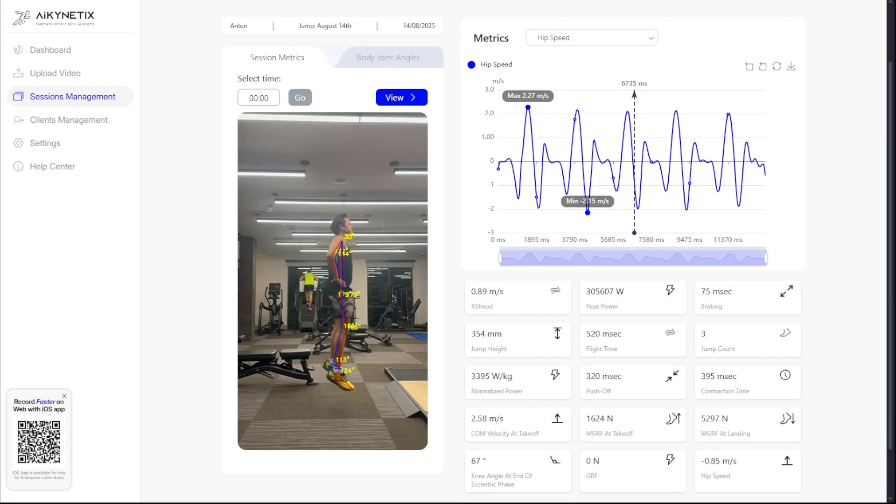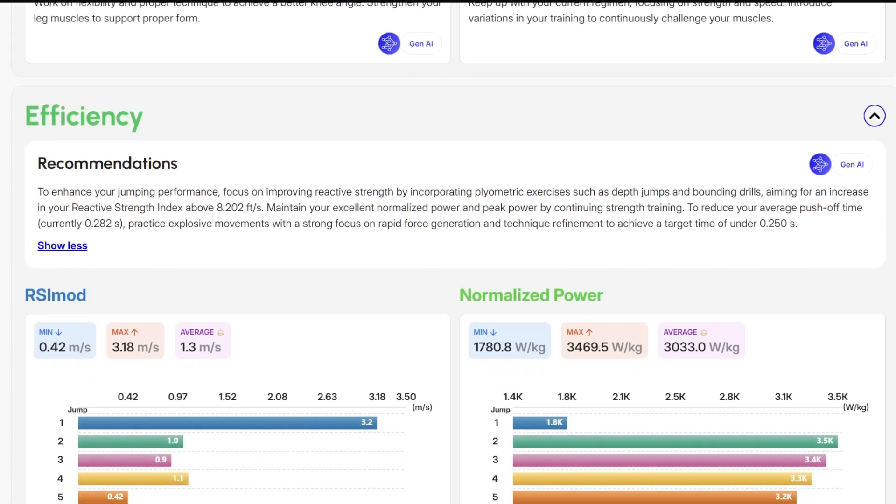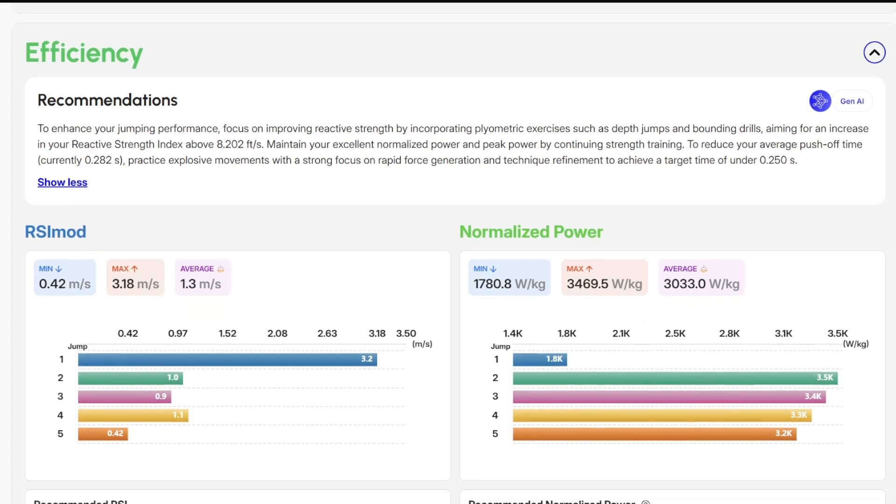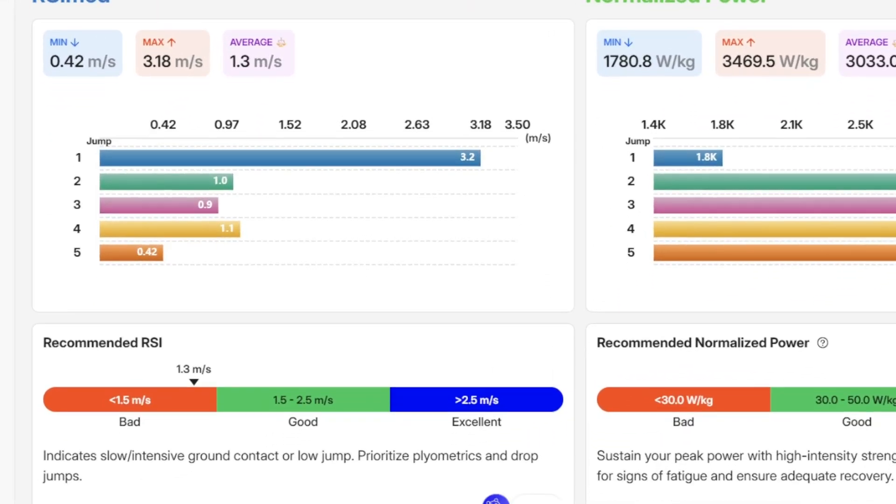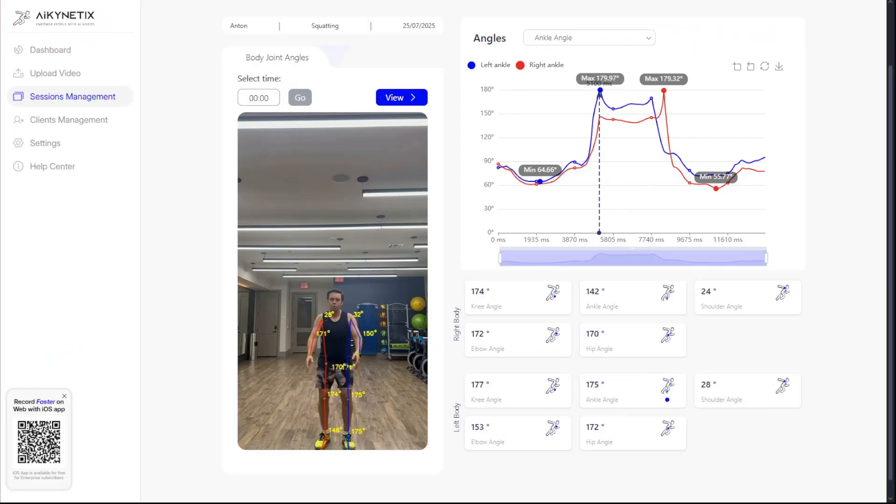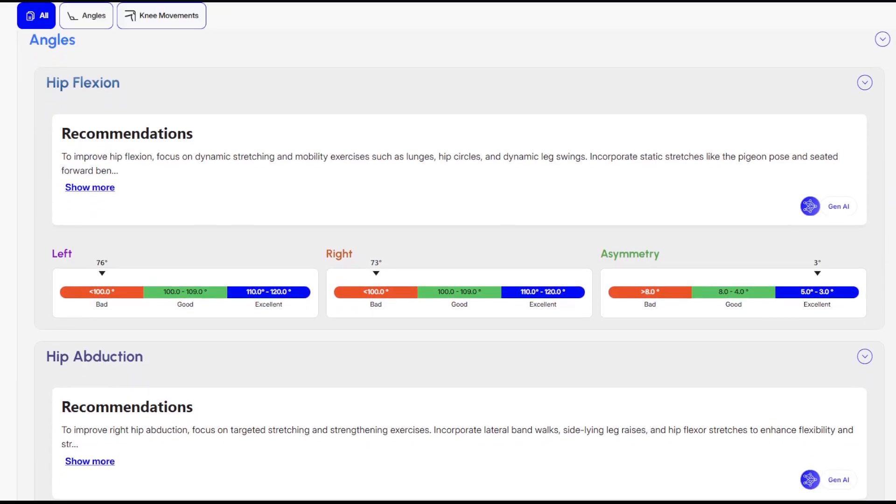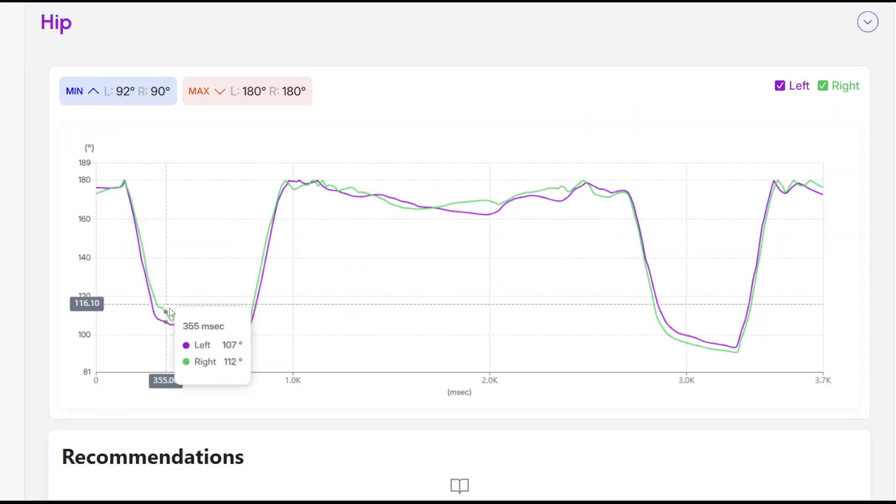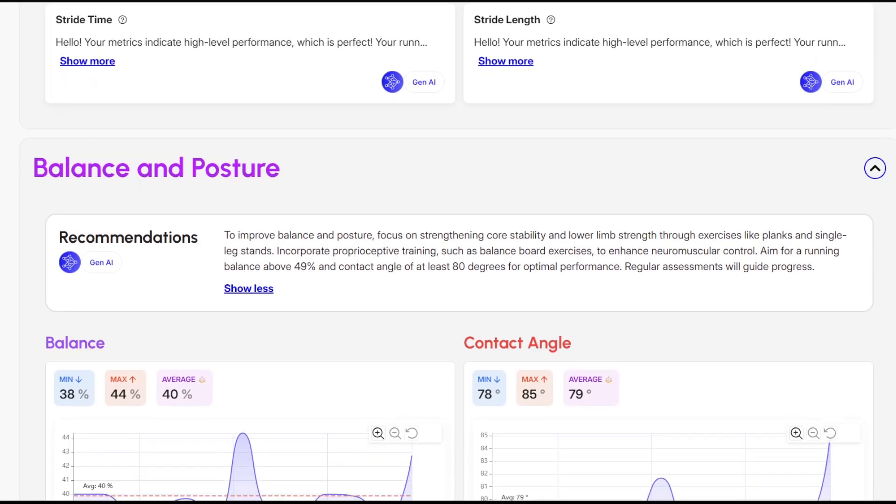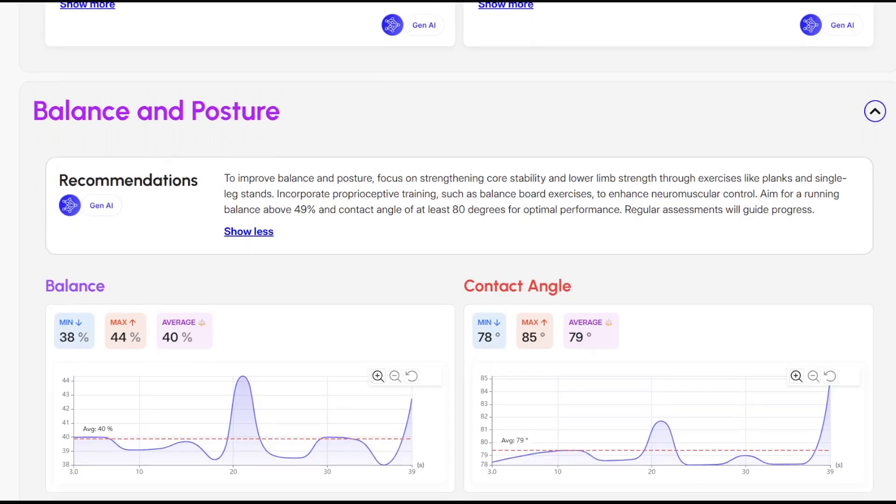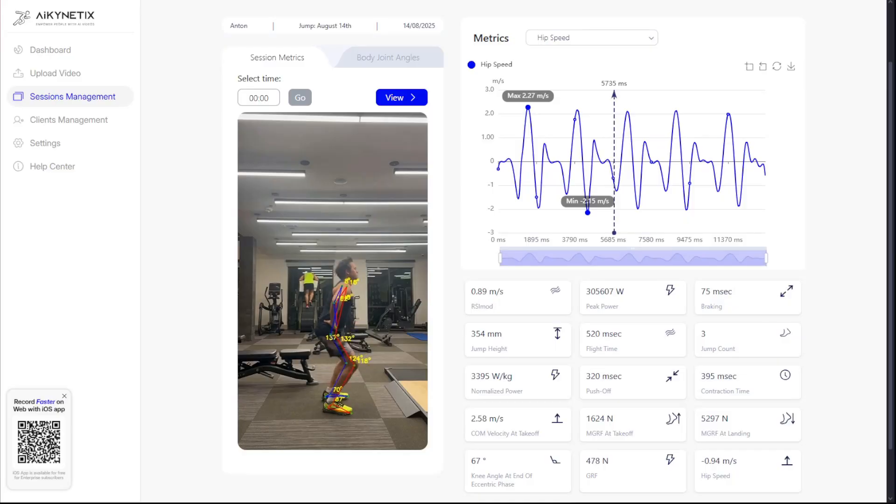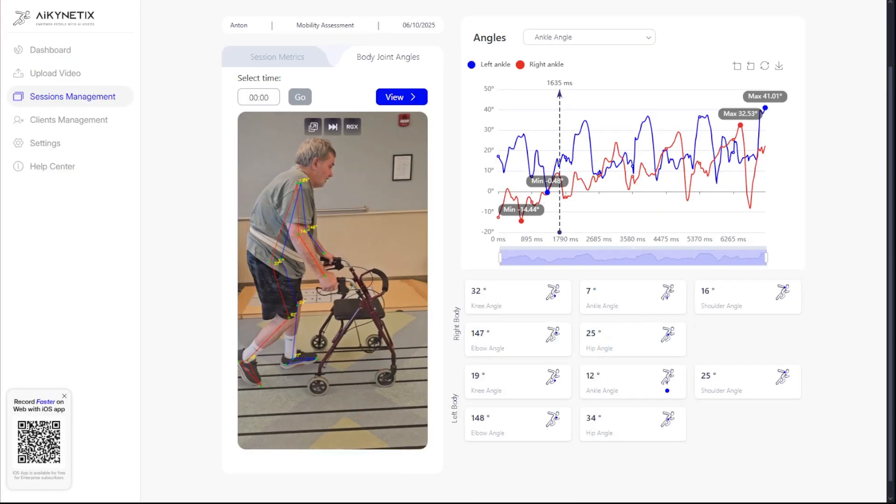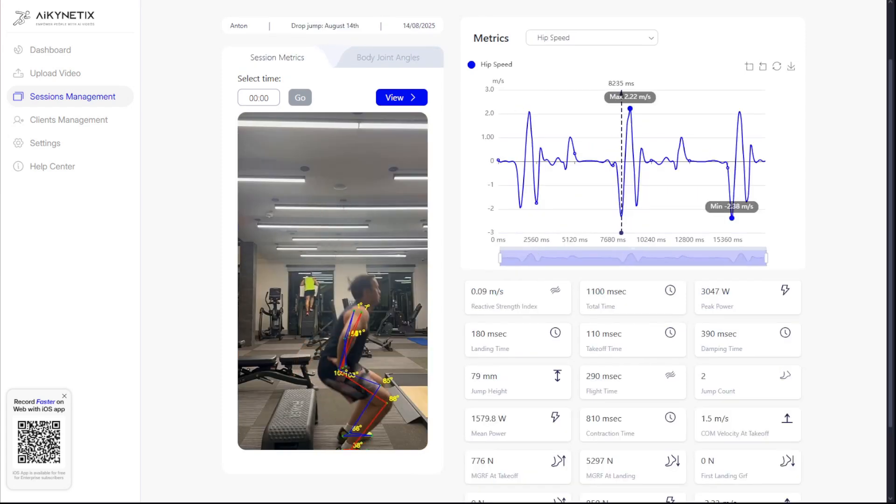So, who is this for? Imagine a strength coach assessing an athlete's jump height and explosiveness with RSI. A physical therapist evaluating symmetry and range of motion during a squat. Or a running coach fine-tuning technique by analyzing contact angles and center of mass movement. AI Kinetics provides objective data for all of them.